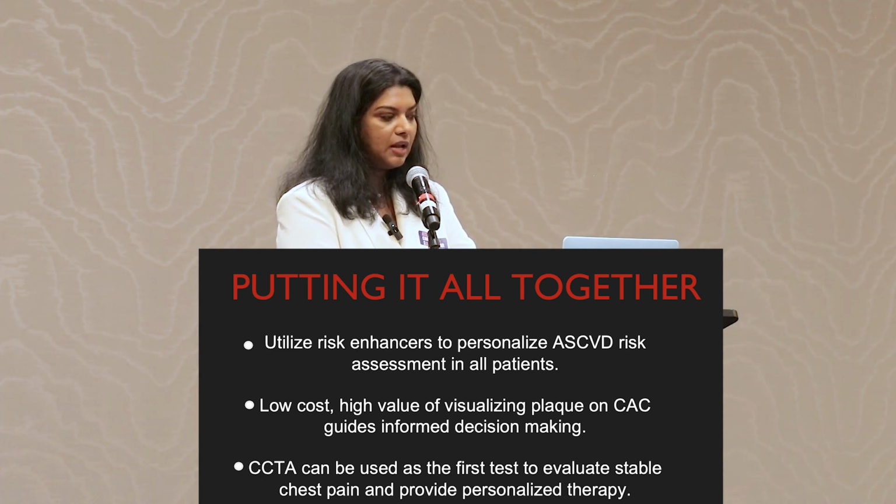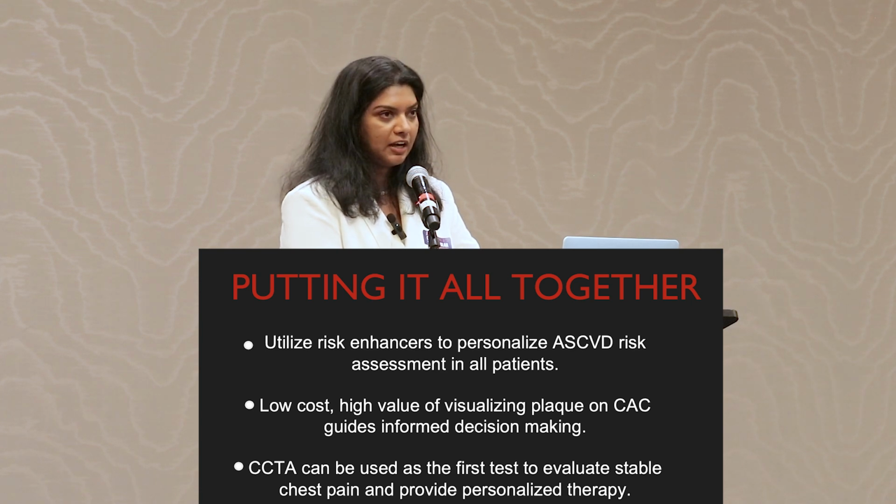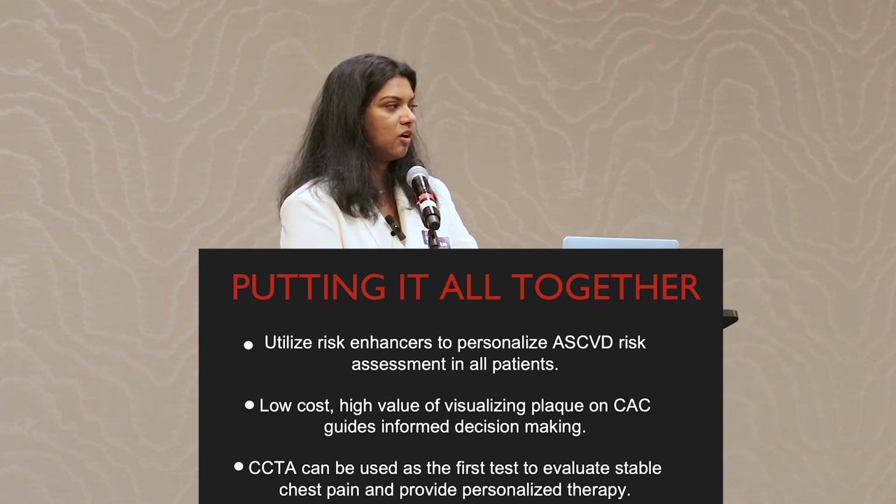As well as we talked about how CTA can now give you that actionable item. You can actually see how much plaque they have, where is the plaque, and talk to your patients with more substance and more depth about this medicine is going to decrease this amount of plaque for you, this aspirin is going to help you prevent a heart attack.